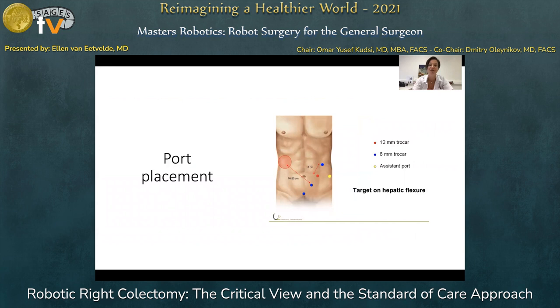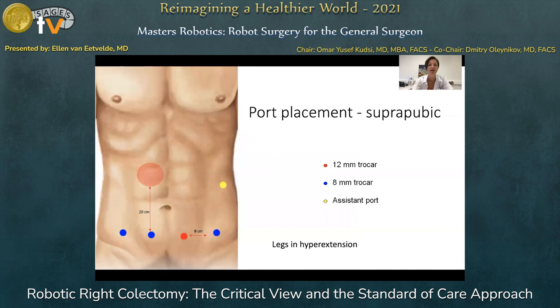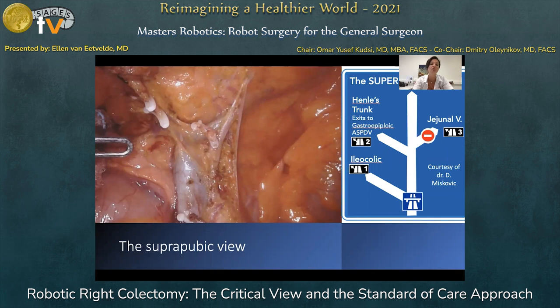Next step for variation is variations in port placement. Once you are used to the diagonal approach, you can switch to the suprapubic port placement as shown here. We keep the camera port in port number two and the stapler trocar in port number three. If the patients are very slim, the most lateral ports can be placed a couple of centimeters more towards the head of the patient, giving a sort of smiley configuration. The suprapubic port placement gives a view like a motorway where the superior mesenteric vein is the main road and all contributing branches to be identified are like exits on this motorway.